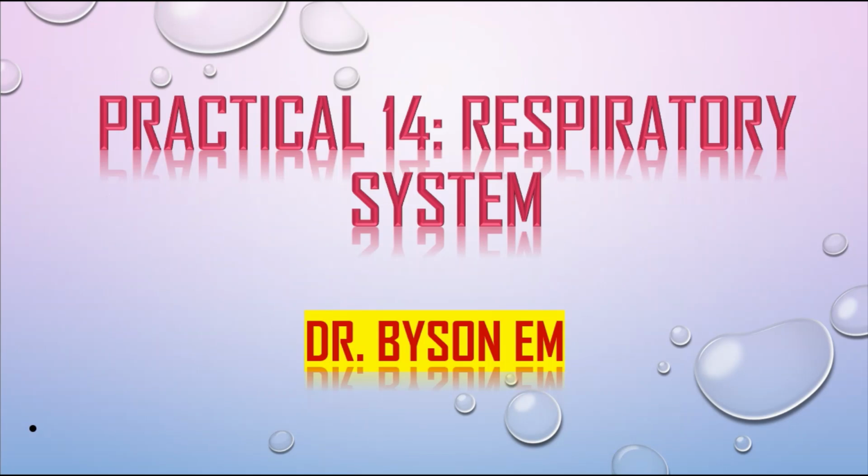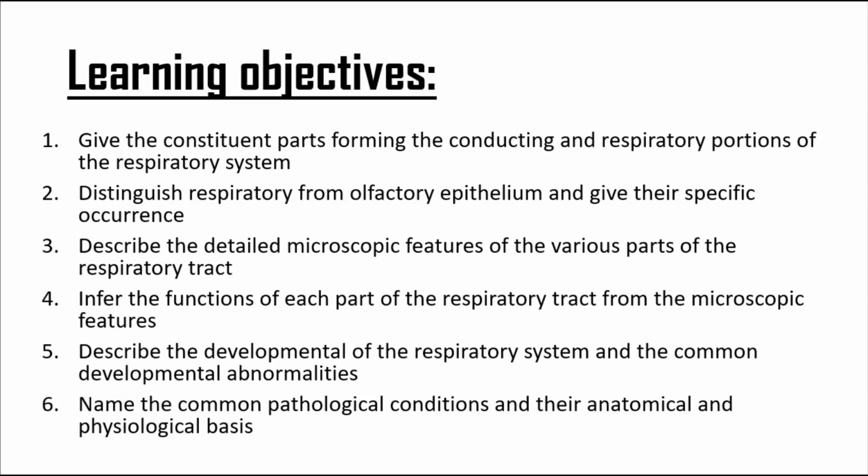Today we're looking at the respiratory system histology, which is practical lab number 14. Let's look at the objectives.